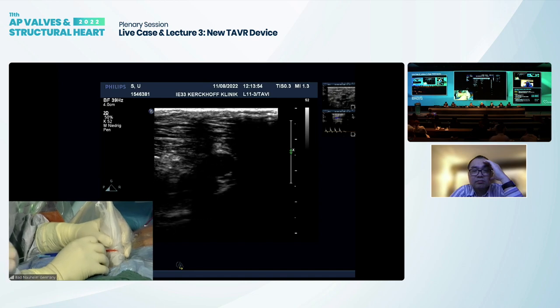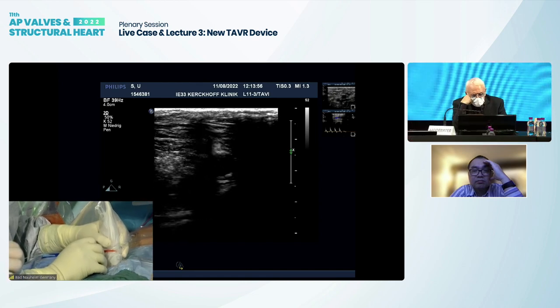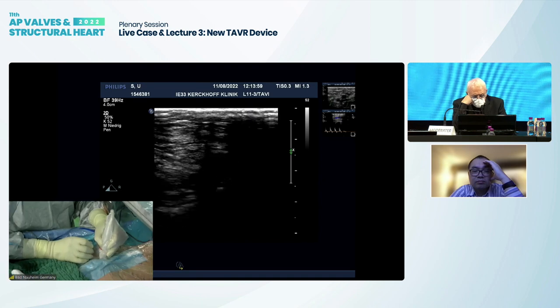Is this your regular approach, ultrasound guided? Yes.